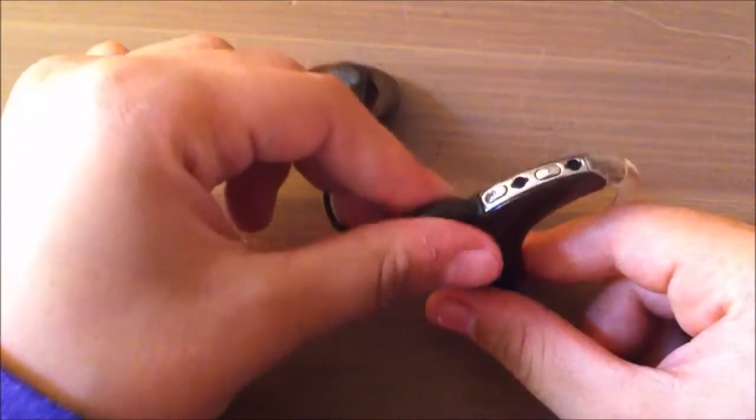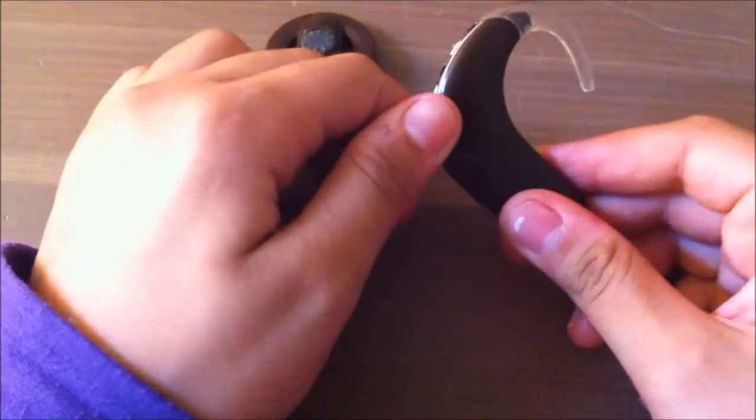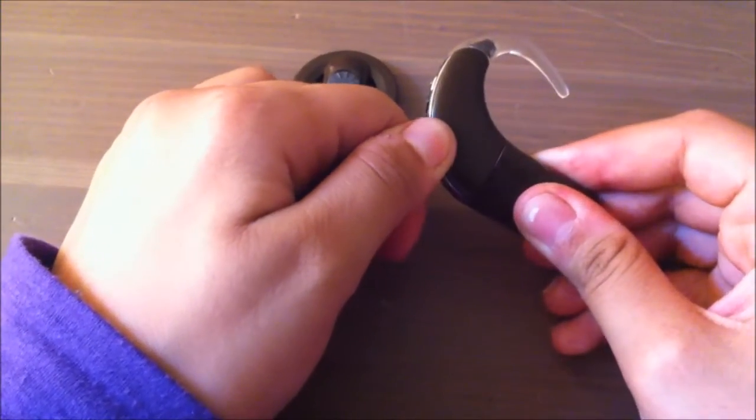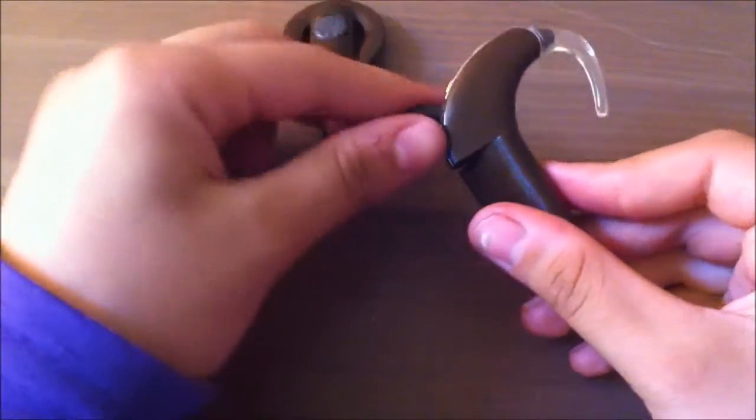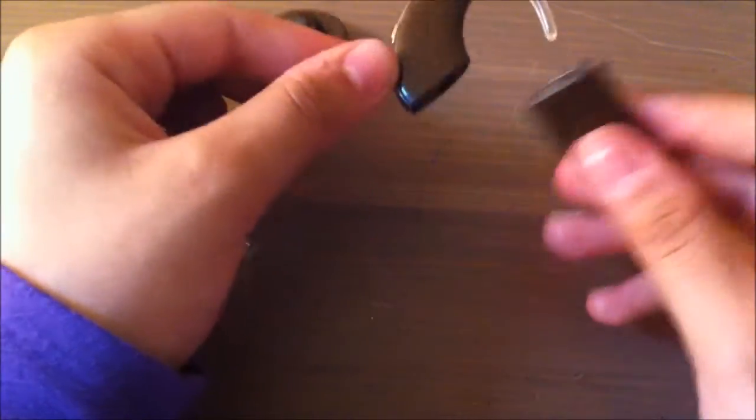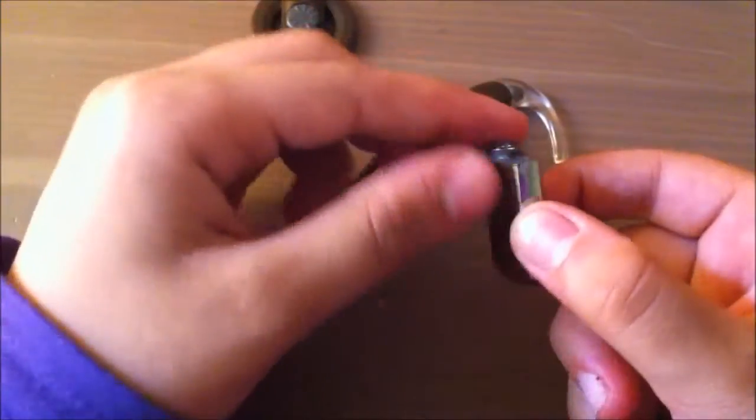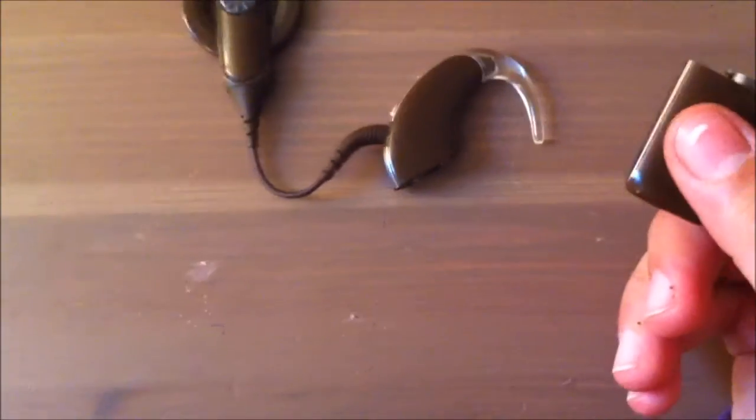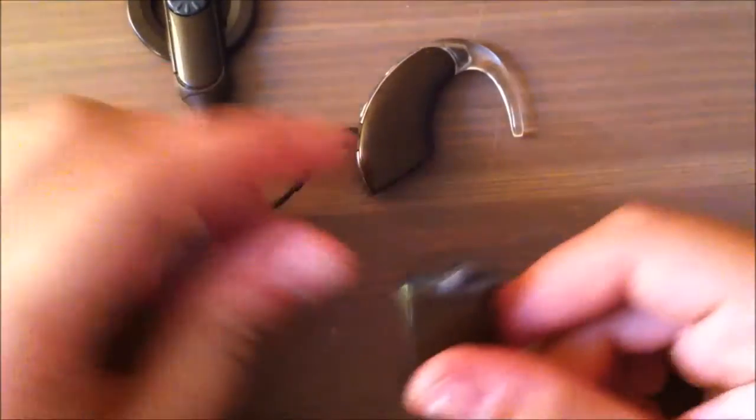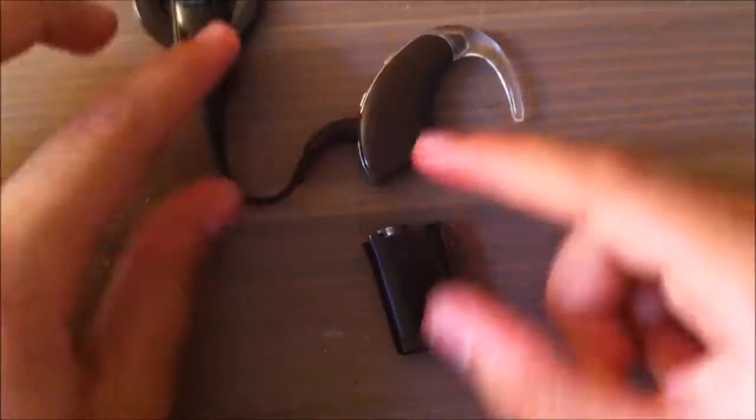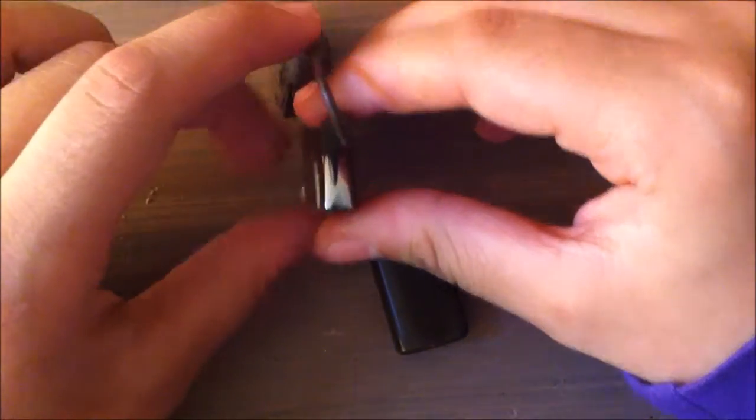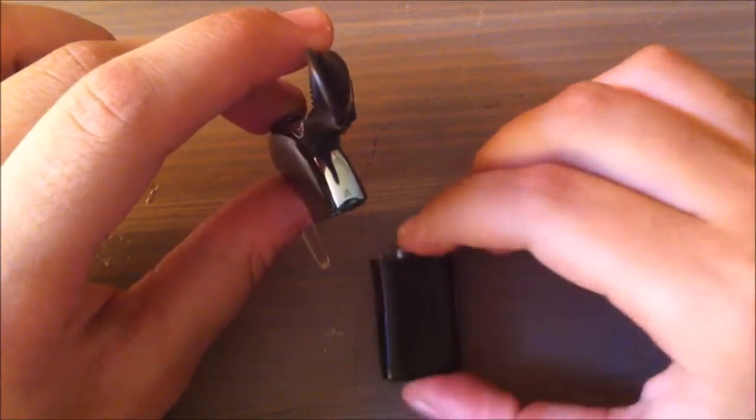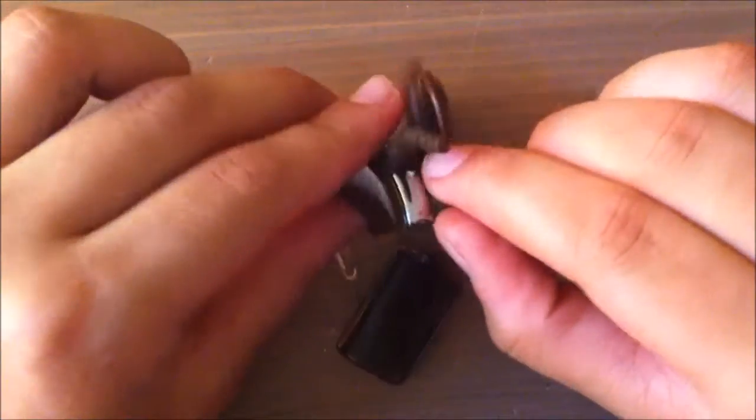So I'm holding it like this, I turn it around like that, and then just twist it to the left, and then I just take it off easily. So that's the battery right there.